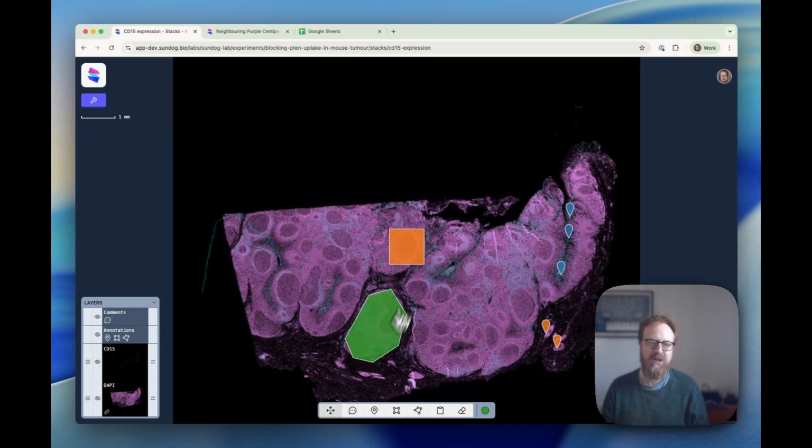And there we go. If I select this orange rectangle, maybe I'm not happy with the color. That's all right. I can tweak it to be green also. And we still know who made it, because when we hover over it, we get the name. So far, pretty simple. You can choose the color of annotations.